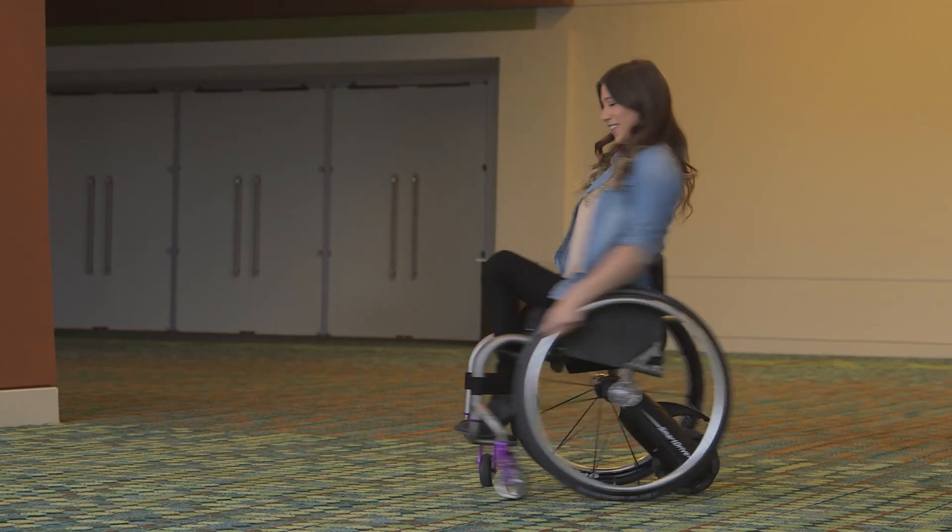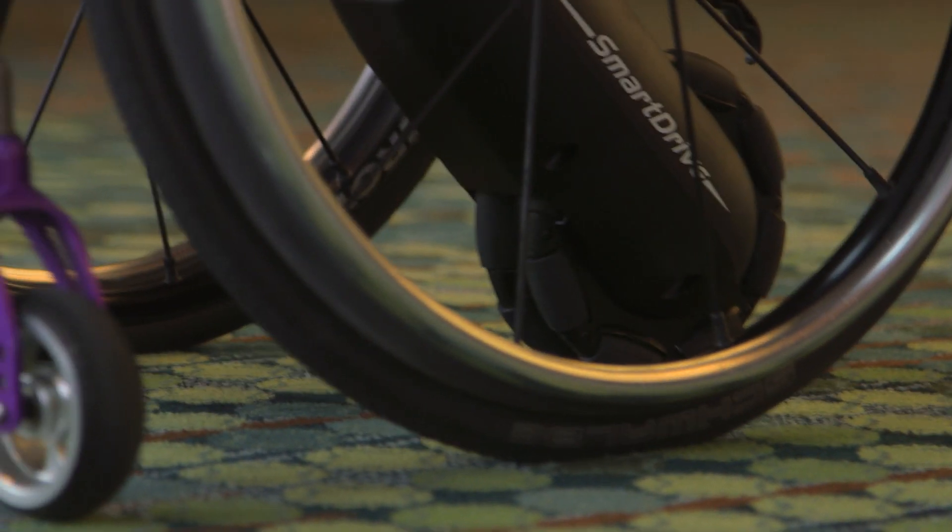The SmartDrive is so lightweight, you'll hardly know it's there. The Omniwheel glides sideways on the ground, allowing you to turn effortlessly.